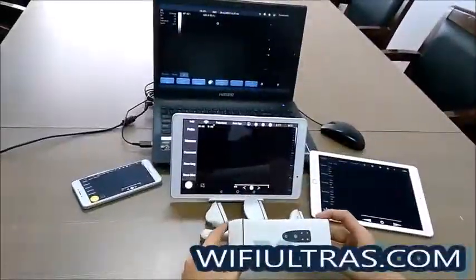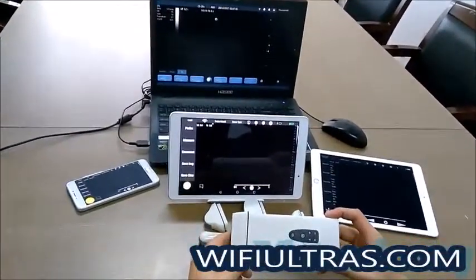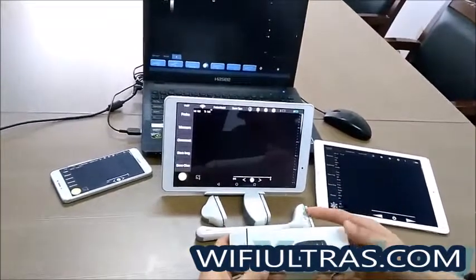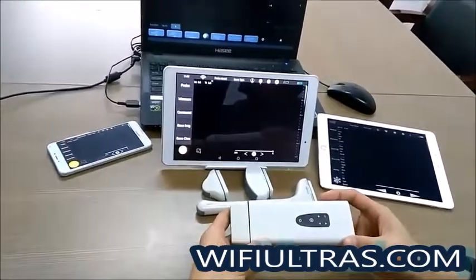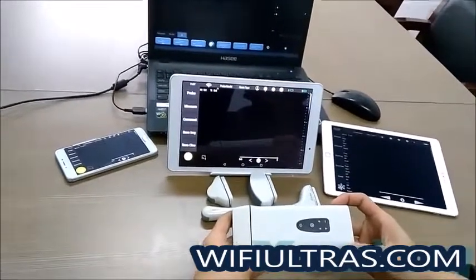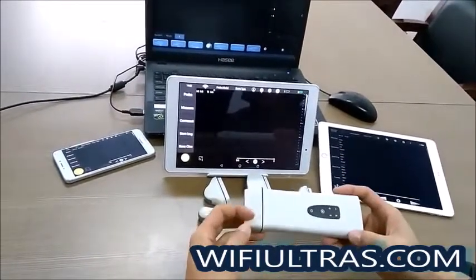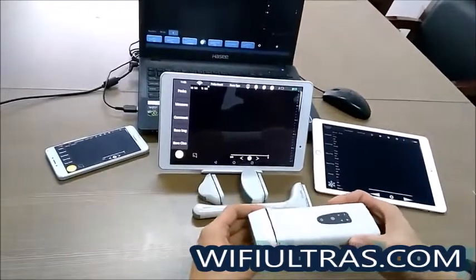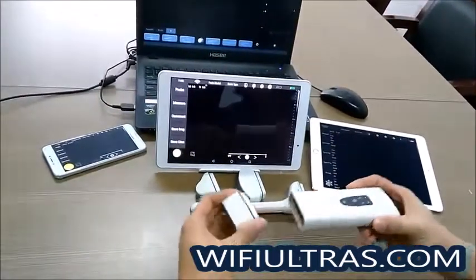Now I'll introduce to you our new wireless ultrasound model. This is the main unit and we can support the convex probe, linear probe, micro convex probe, and transvaginal probe. The probe is a detachable design and you can change the probe like this.